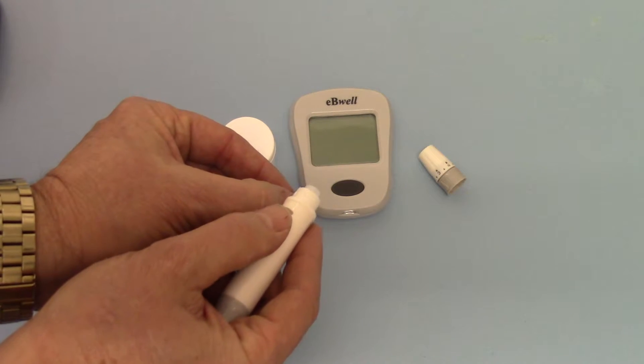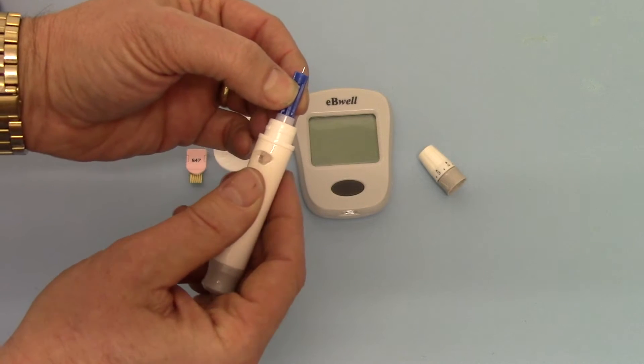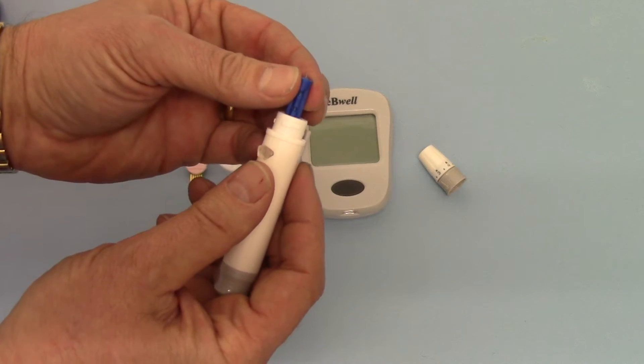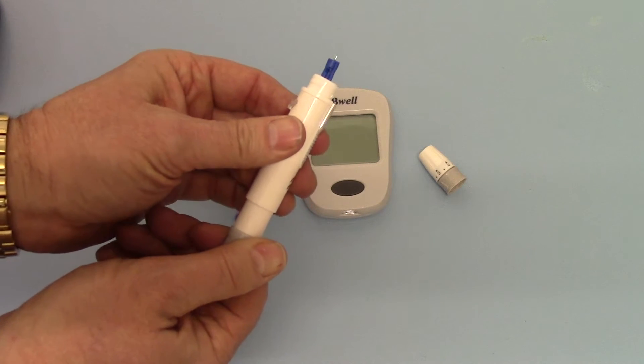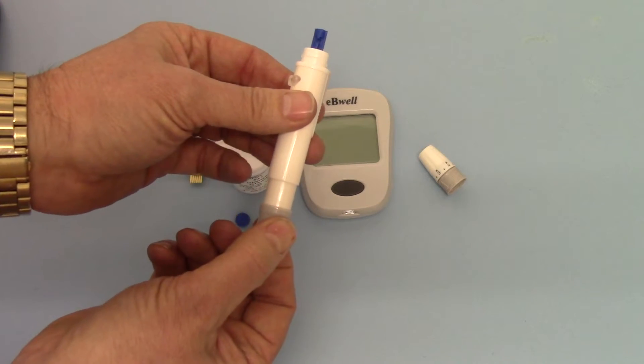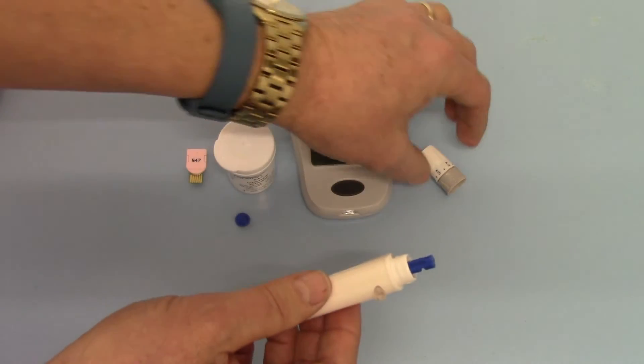You then have the sterile metal lancet protruding from the base. This is then fitted into the auto lancing device, and then the meter is primed by pulling back on the stopper at the end and that is now locked in position.